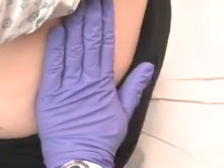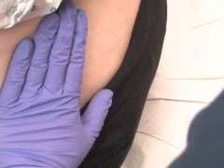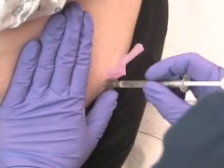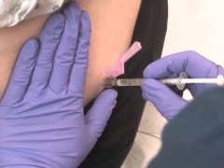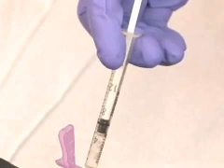With your non-dominant hand, pull the skin laterally toward the side opposite the site. Quickly but lightly thrust the needle into the site at a 90-degree angle. Continue holding the skin away from the needle site and inject the medication.